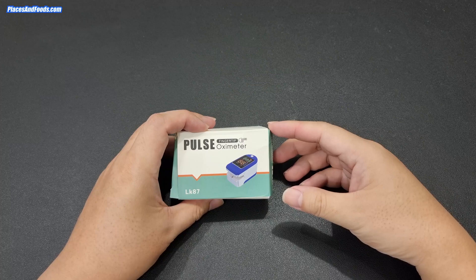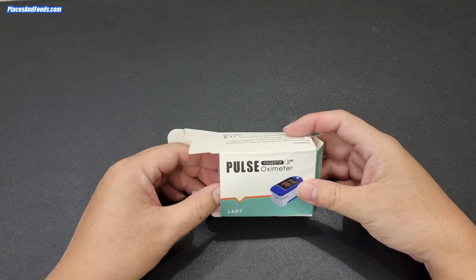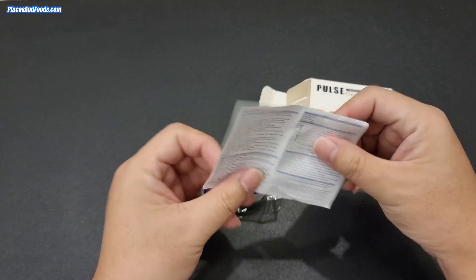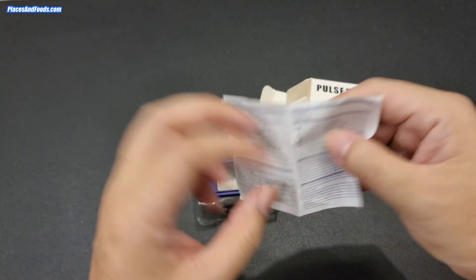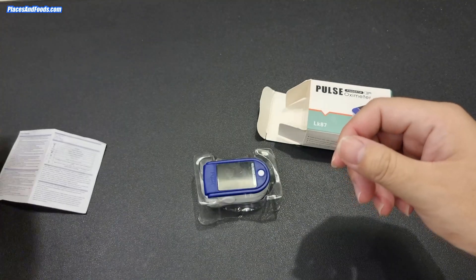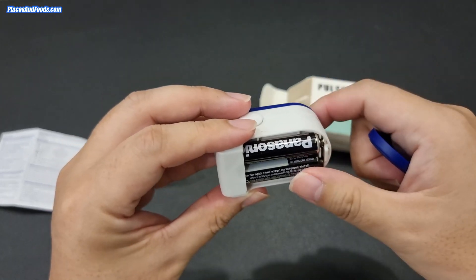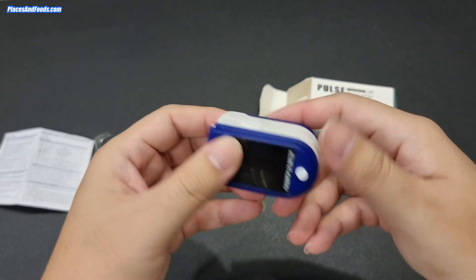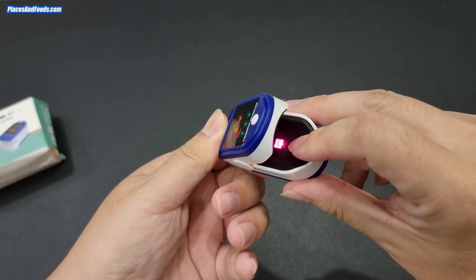There are a lot of oximeters out there and this is just one of the cheapest. I'm going to do a quick unboxing. As you can see it's quite beat up from delivery, and it comes with an instruction manual that is so small you need super sharp eyes to read it. This is the oximeter, and it doesn't come with triple-A batteries, so I bought those separately.